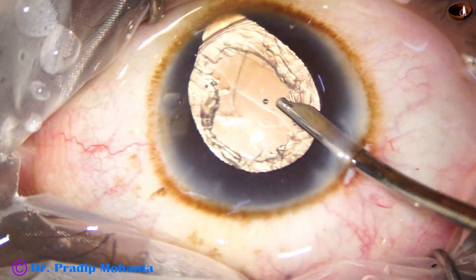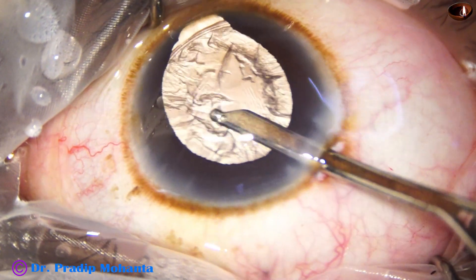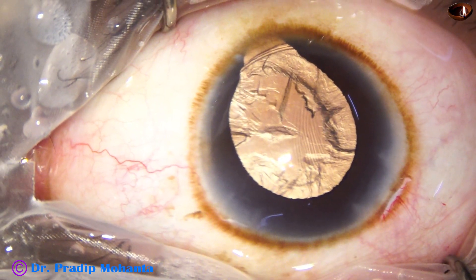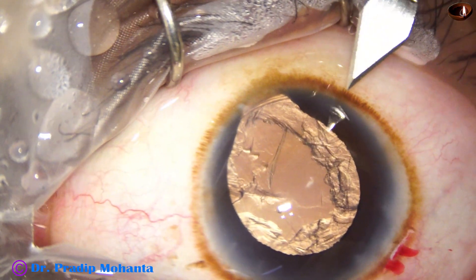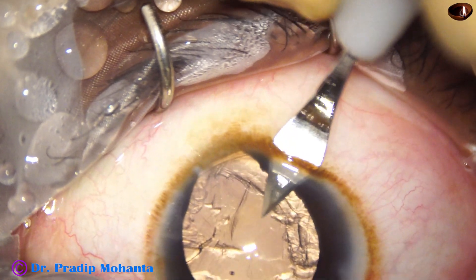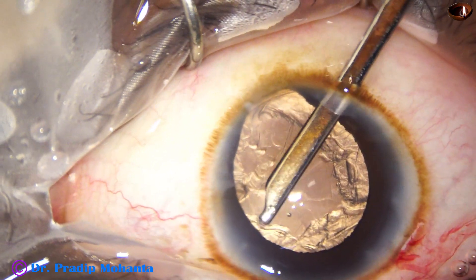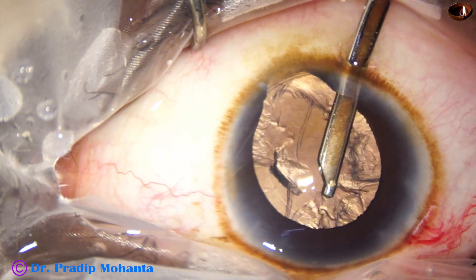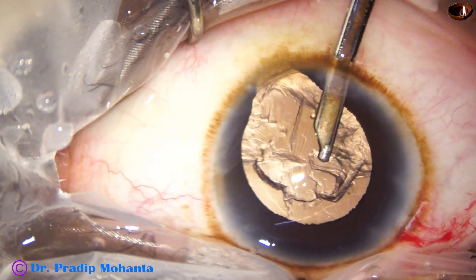With the CTR in place, it is difficult to remove the cortex, particularly from the area where there is a zonular defect. I come out of the AC and inject visco again to fill up the anterior chamber. My plan is to make a side port at 7 o'clock, and through the side port I am going to remove the cortex from the upper part where the zonule is strong. Going to 10 o'clock, I could remove the cortex easily — then 12 o'clock and then 11 o'clock. The cortex from the upper part is coming quite easily.